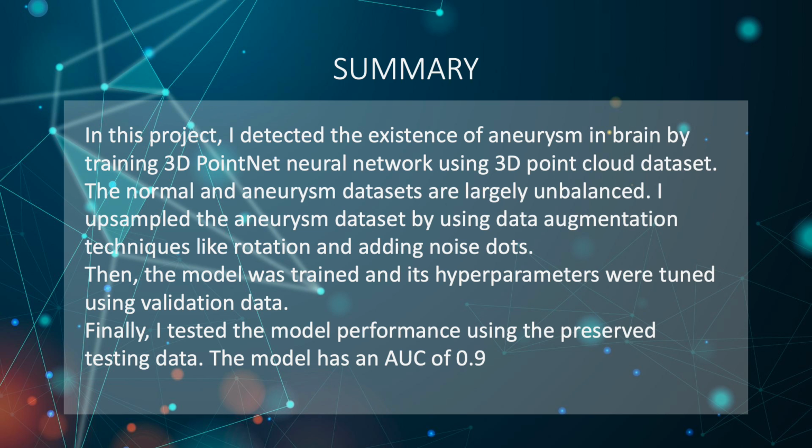In future work, I will focus on increasing the prediction accuracy on aneurysm samples. I noticed that when people check the 3D images, they usually rotate the image to find the aneurysm. I will implement this mechanism in aneurysm detection for the trained models.